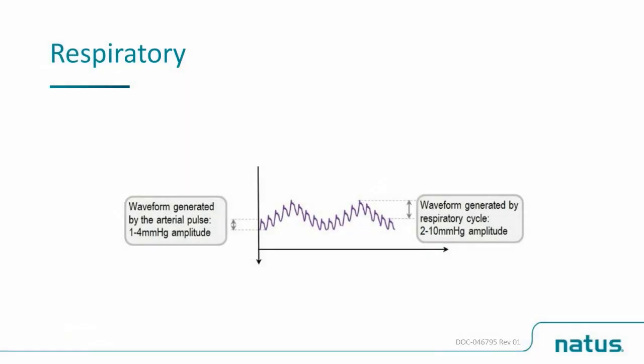Relation to the respiratory system is perhaps not as obvious. In the image above, you can see the individual ICP wave and a larger respiratory wave that is consistent with our respiratory pulse. Why does this happen? It happens because our respiration has an effect on our cardiovascular system.